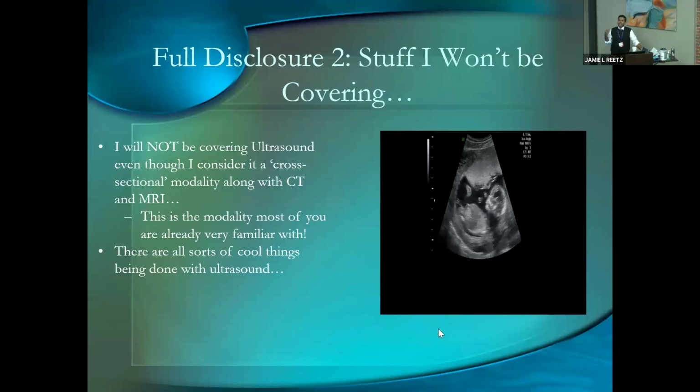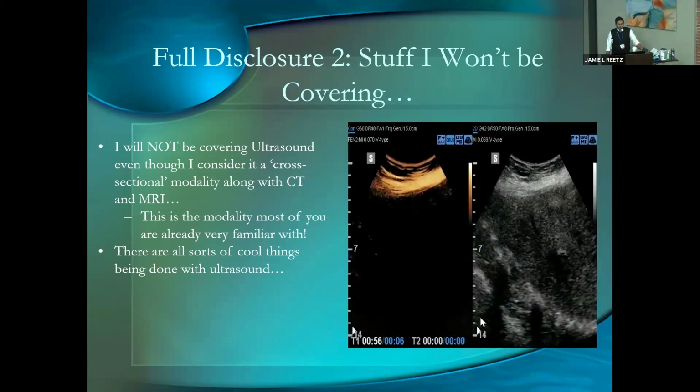Another caveat that I'm going to say is I will not be covering ultrasound. The reason why is besides radiology, I really feel like OBGYN is the next essential specialty that is most vested in ultrasound. And so I'm sure you get tons of lectures about it. I'm going to skip over all of that to focus on the stuff you might not get lectures about. There are all sorts of cool things being done with ultrasound that I feel could be done in a different practice setting.